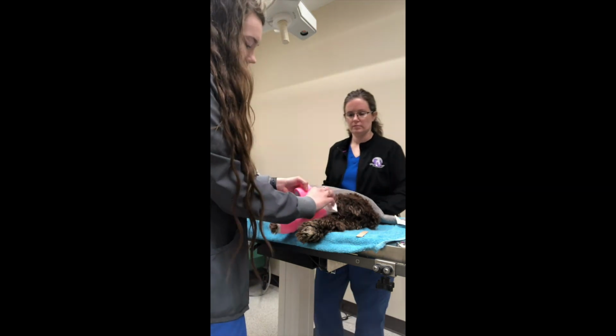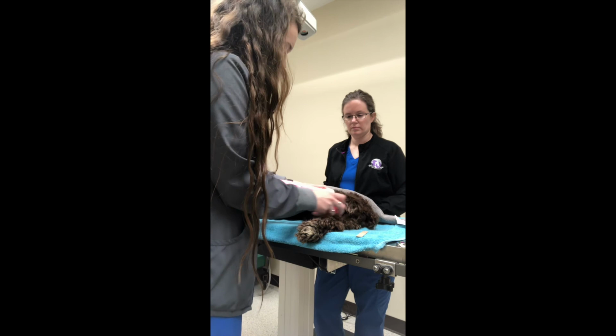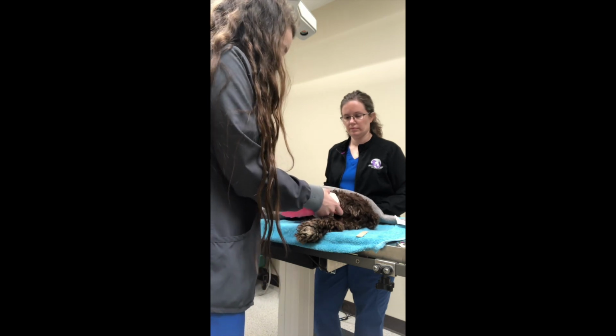And around at the top of the splint, we added some extra padding just for comfort so it does not rub the leg.